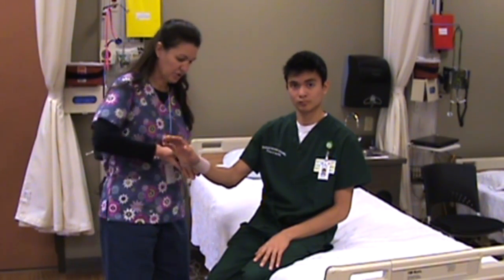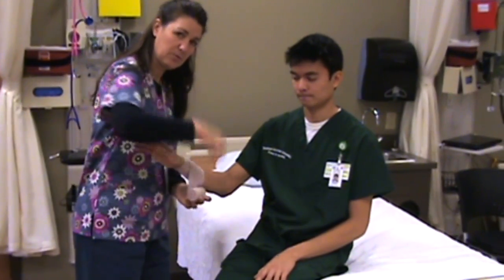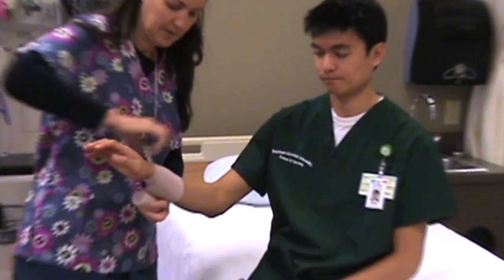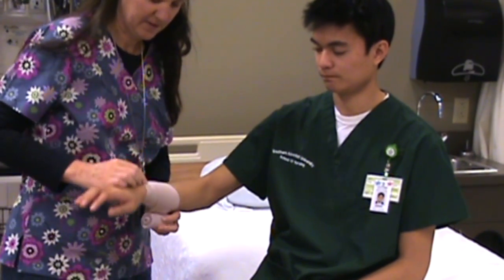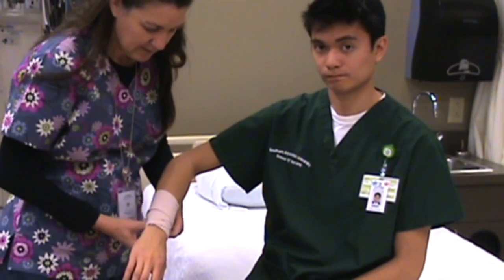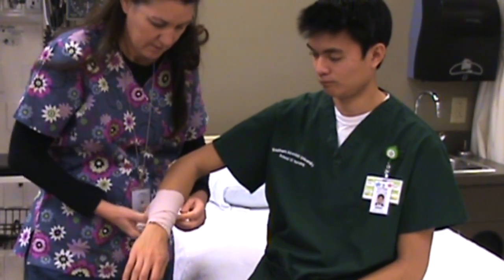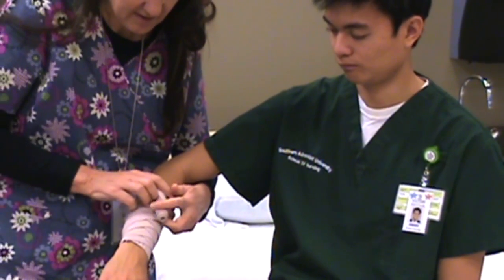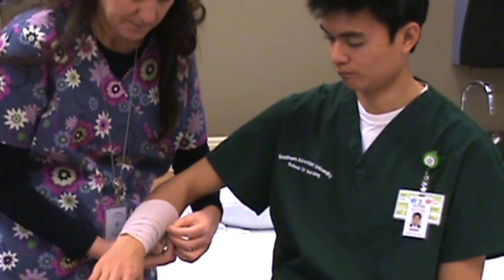So this is a little circular wrap to hold it, and then next I go up like I'm going to do a spiral up, but the next one I come down and it just holds it a little bit better than the spiral, and then the next one goes up and the next one goes down and the next one goes up. And if you look closely, you can see that it looks kind of like a braid going up the arm.